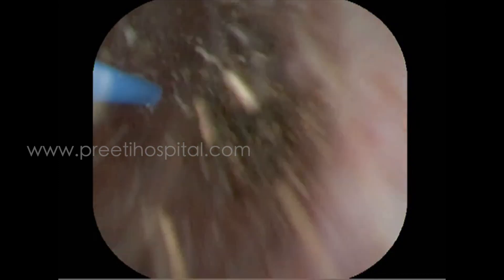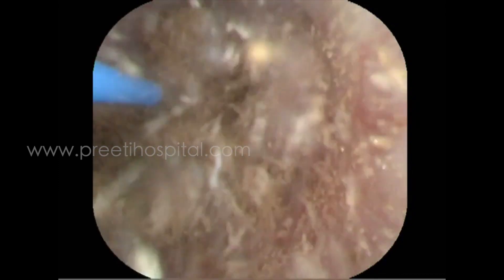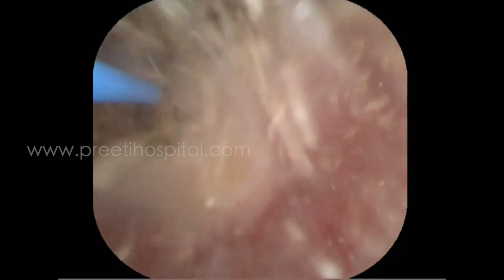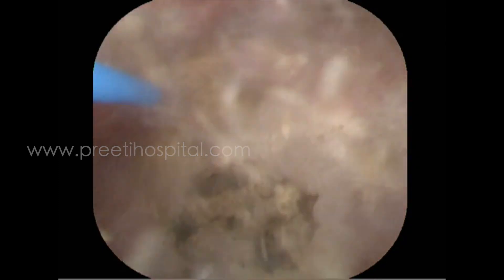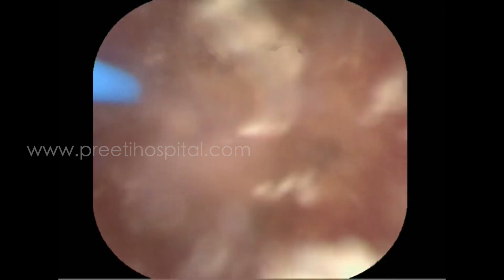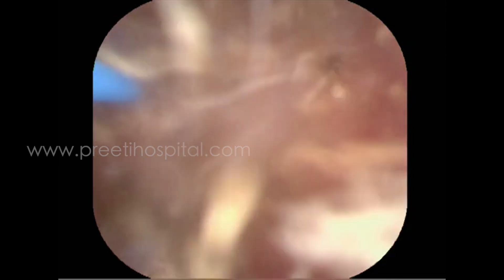I spent enough time to make powder, but some small fragments will remain. All these years those small fragments we used to leave for nature to pass off — they usually pass off also. I am not saying they won't pass off, but one or two fragments may remain and may be seen on ultrasound.